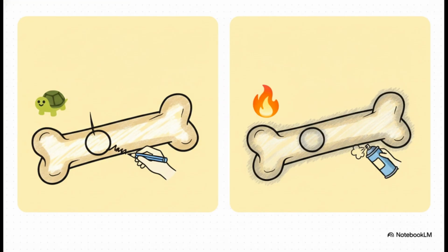On one side, you've got a non-aggressive lesion. It has a narrow zone of transition, a really sharp, clean line, almost like someone drew it with a pencil. That tells us it's growing slowly. But on the other side, that's an aggressive lesion. It's got a wide, blurry, ill-defined border, kind of like it was made with a can of spray paint. That suggests super rapid growth, and right away, the alarm bells for something like a malignancy start going off.